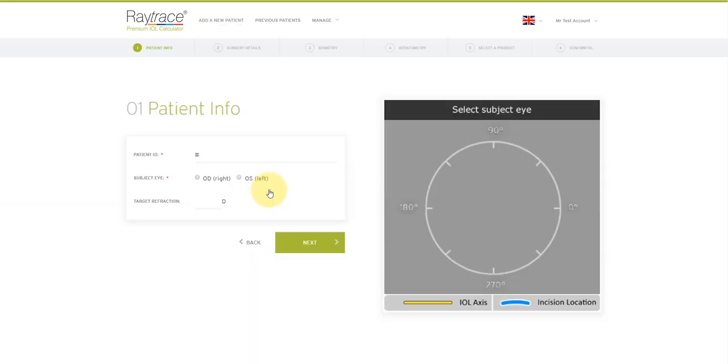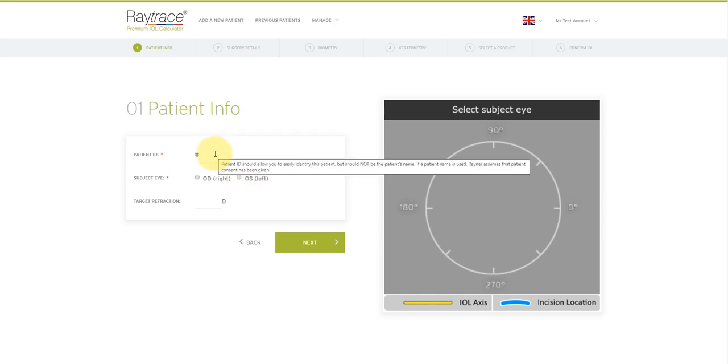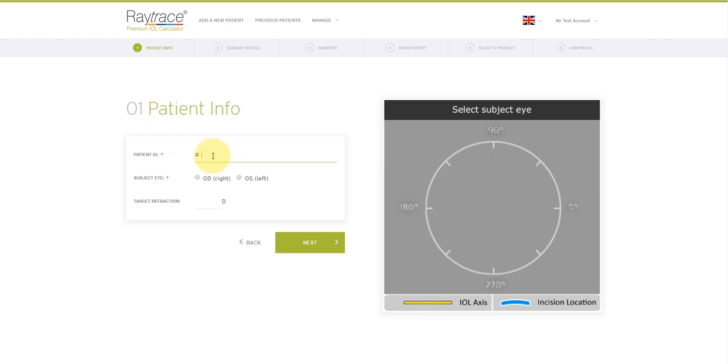Now we have to enter the patient's details. Patient ID is a mandatory field and helps to ensure a clear association between the lens calculation and the patient. Hover over the patient ID for notes about this data field. There cannot be any spaces between the characters. And if a patient name is used, Rayner assumes that the patient has consented to being added to Raytrace. So in here, I'm going to add a patient ID of one, two, three, four.